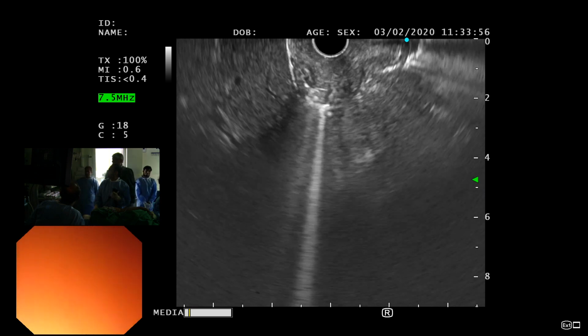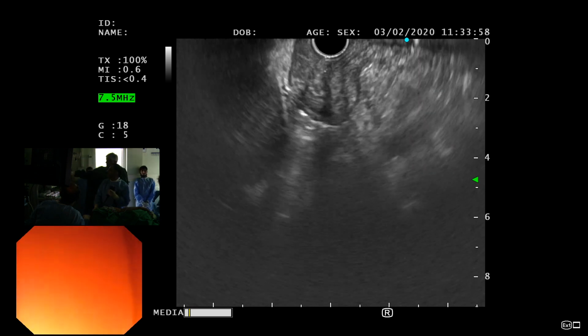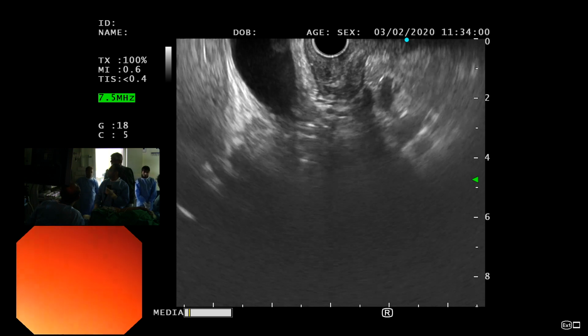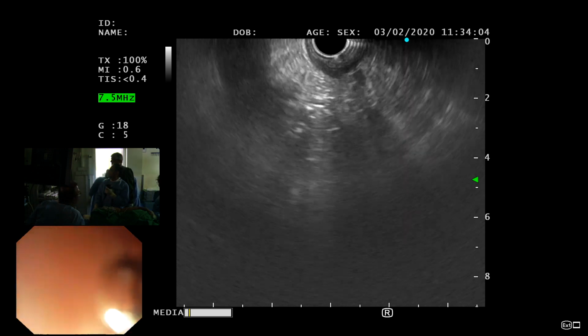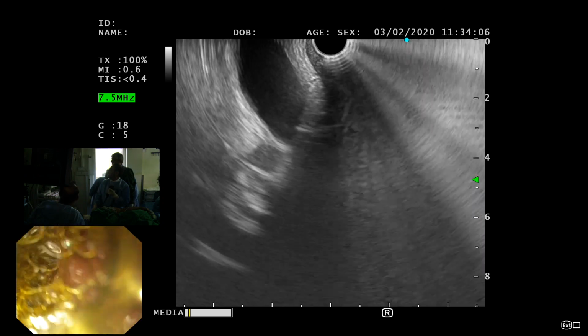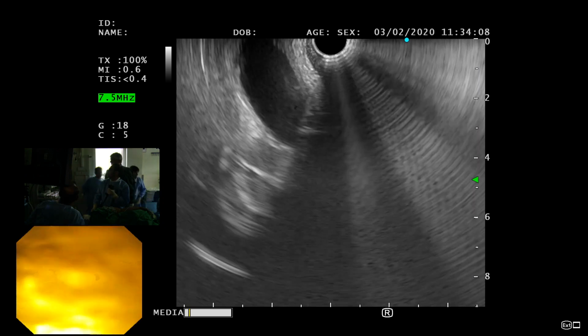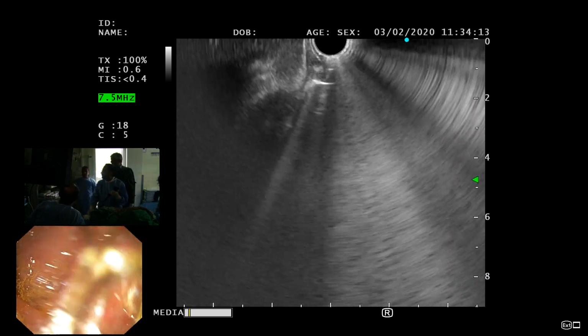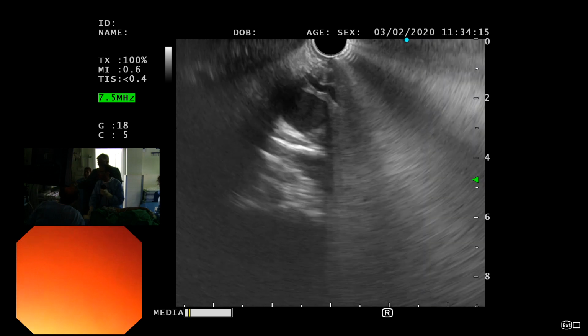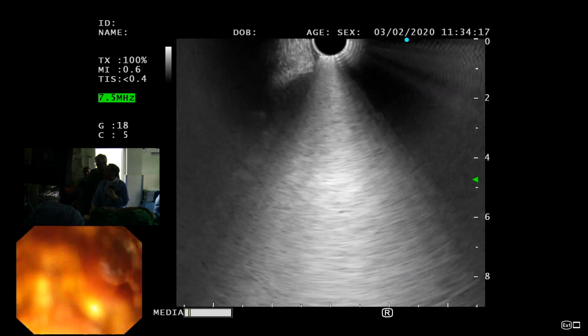So thoda sa dekhein, pull back karke. Now you're looking at the liver. गॉलब्लैडर ठीक है. Most likely. Yeah. गॉलब्लैडर होगा. लेकिन आप देखें बाहर आ गए मेरे ख्याल में. You're out. So you go back in. And as soon as you enter, don't go too far. Just in the bulb. Yeah.